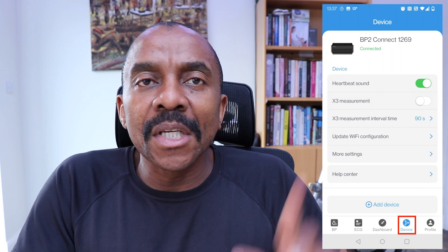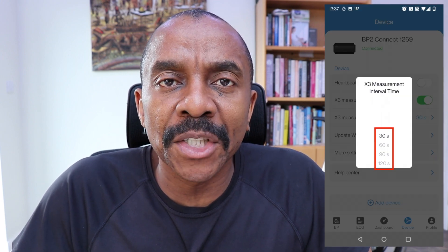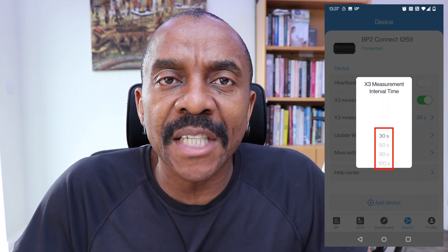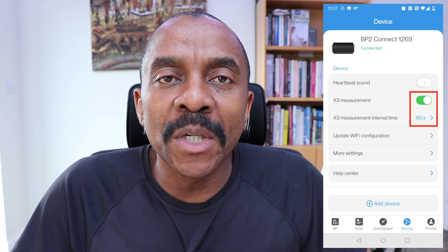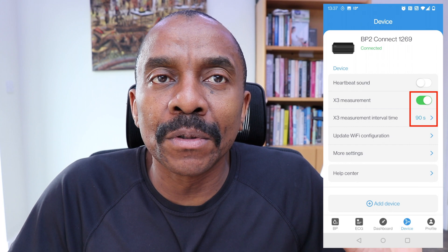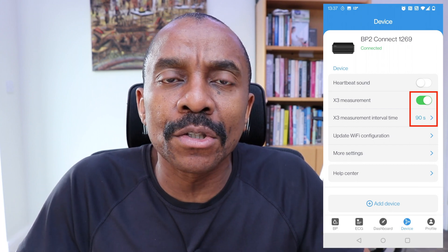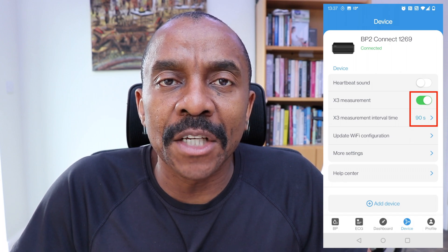When you tap on the device icon, you would see a screen like this. The blood pressure monitor has the capability of taking three consecutive blood pressure readings at intervals of 30 seconds, 60 seconds, 90 seconds, and 120 seconds. You can switch that on and the interface on the app would look like this, enabling the blood pressure monitor to take those readings at the interval that you set.